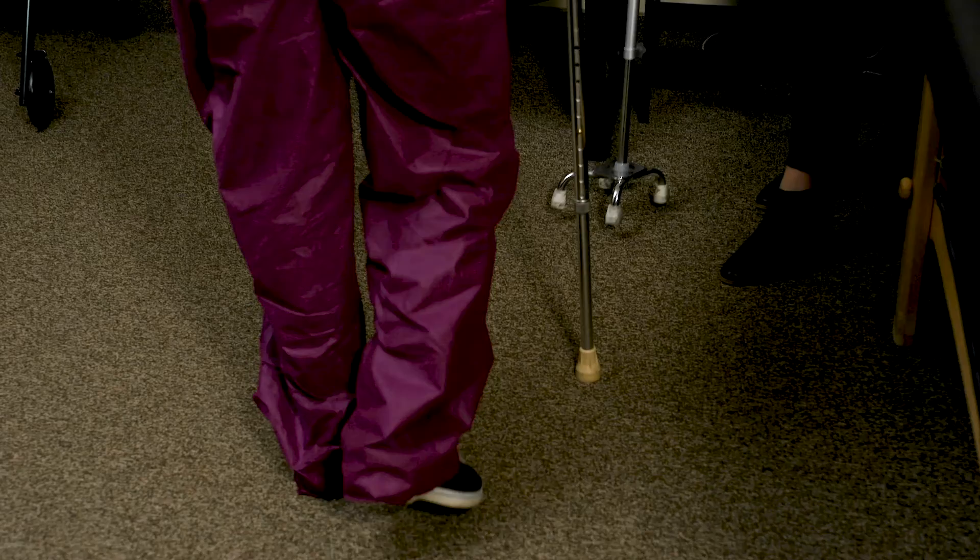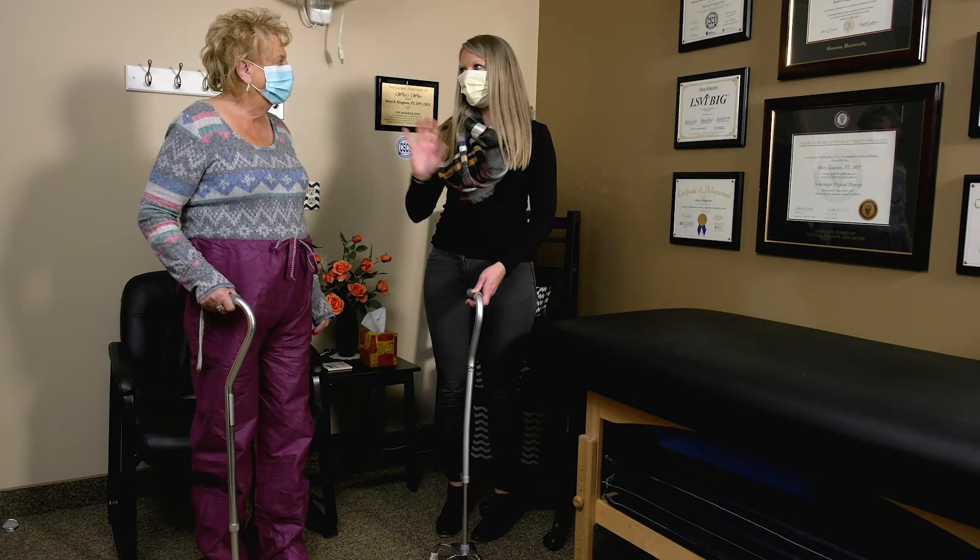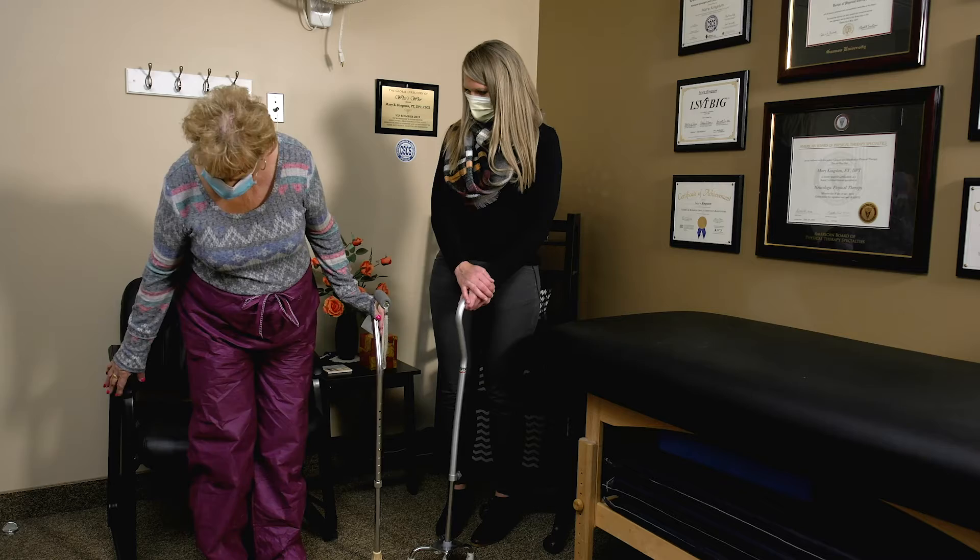Turn around. You want to make sure that the foot opposite the cane goes with the cane, so you're going to do cane, left, right — good. Then turn around. When you go to sit back down, always reach your hand back for the armrest of the chair, and then you can have a seat.